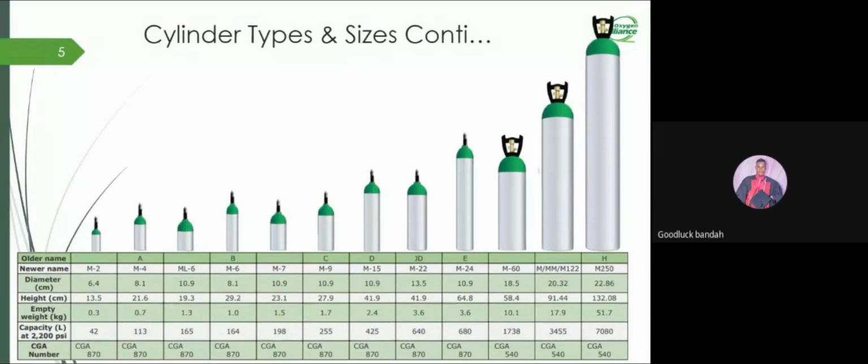Oh, thank you, Lloyd, and thank you, Bernard. Yeah, MR cylinders are available, but these cylinders should be non-ferrous because we know MRI is highly magnetic. So cylinders used with MRI use non-ferrous materials or metals. Thank you.